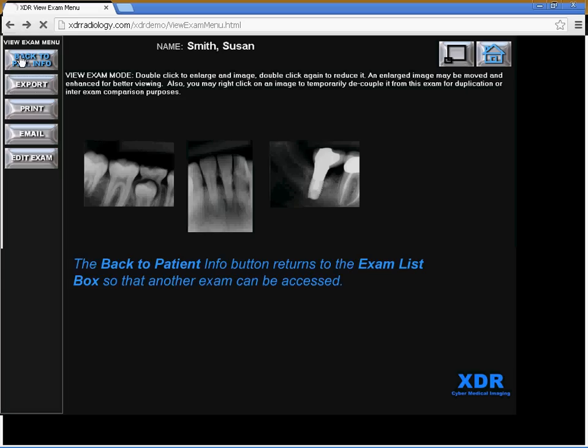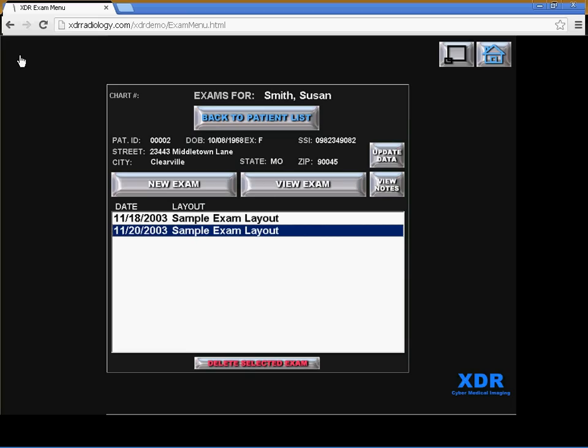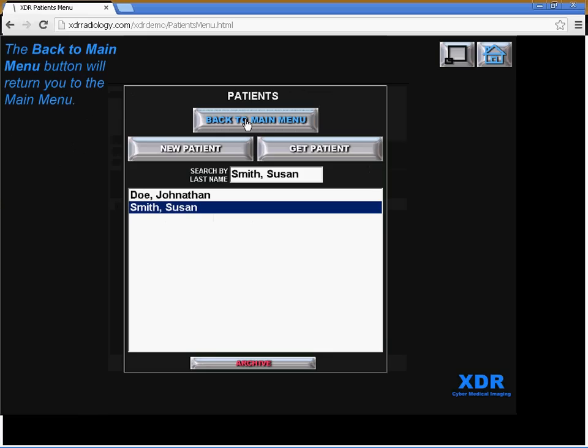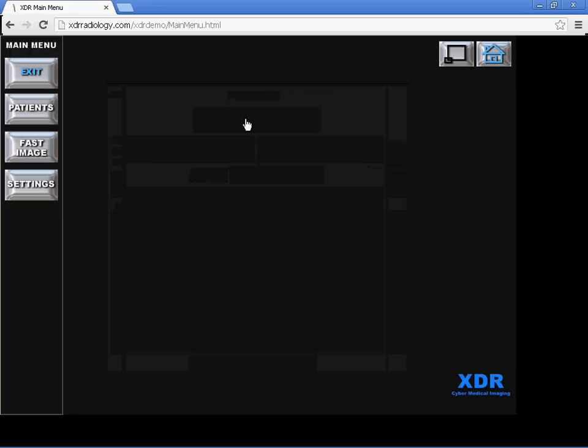Let's go back to the patient info and let's go back to the patient list. Go back to the main menu.